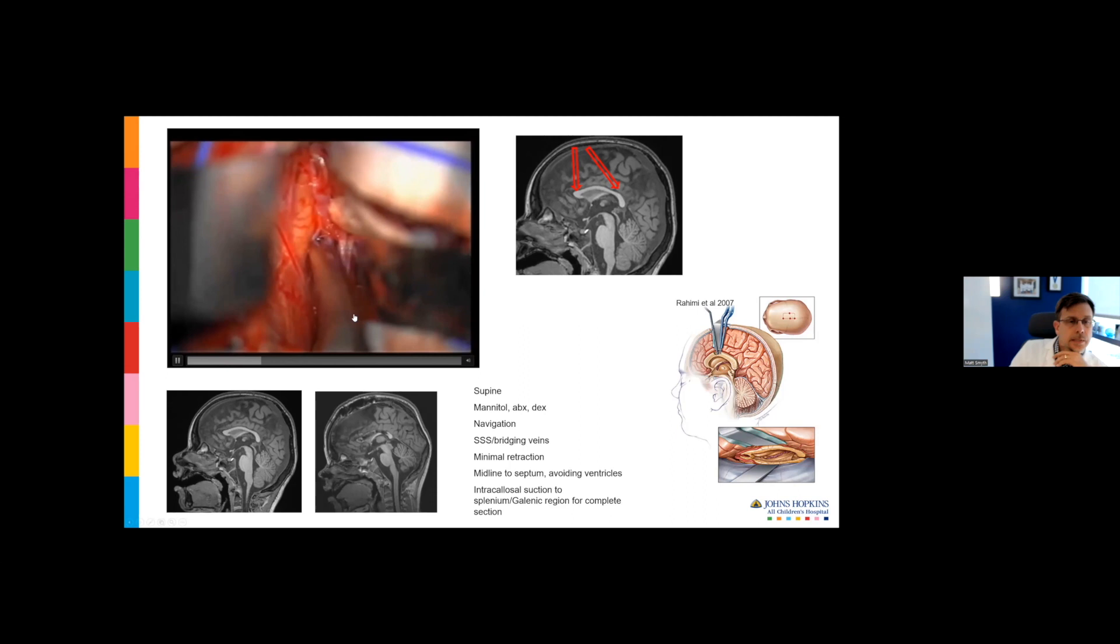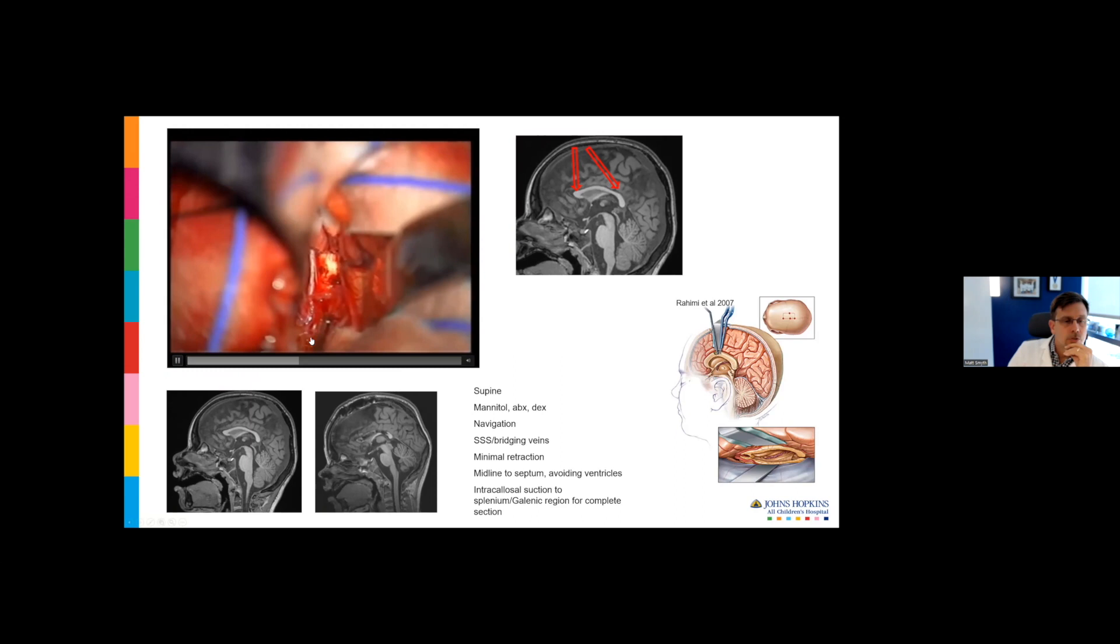Often the cinguli are stuck together, and you need to dissect them apart. Here you can see the glistening white structure, the corpus callosum, the pericallosal arteries, and the callosal marginals. We're teasing them apart. This particular patient had a unique variation of anatomy where there was an accessory anterior communicating artery between the two callosal marginals.